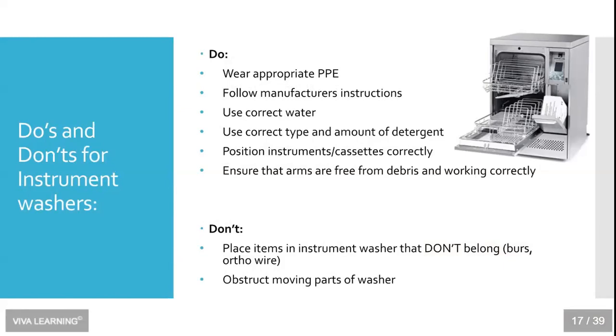Now, do's and don'ts for instrument washers. Once again, wear personal protective equipment when you put instruments in and remove instruments. Follow the manufacturer's instructions for use. Use the correct water. Use the correct type and amount of detergent. Position the instruments and cassettes in there correctly.